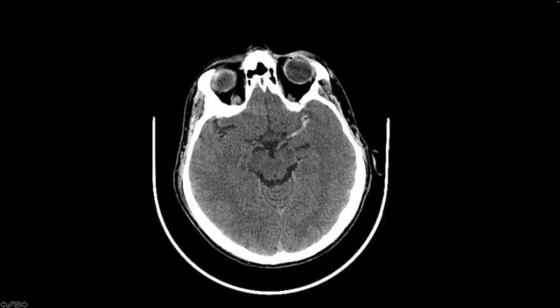So here's an example — an axial section through a non-contrast head CT. You'll notice that this M1 segment and some of the proximal M2 segments of this left middle cerebral artery are very hyperdense. Here is the contralateral right M1 segment that you can just kind of partially see here — you can see it's much less dense.